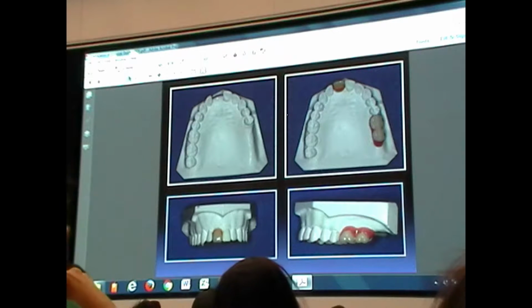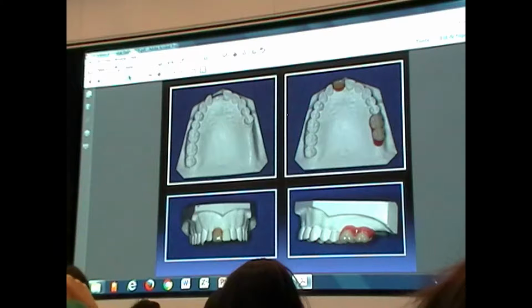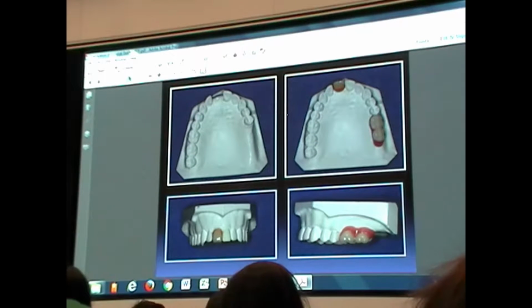So here in the top left-hand corner for you is your patient. And we've utilized 3 denture teeth to create the anatomical form that we desire. Okay? It doesn't necessarily have to be all fancy with the pink wax, but you need to take the time to make sure you're developing the appropriate contours now, so that the surgeon puts the implant where you desire it to be.